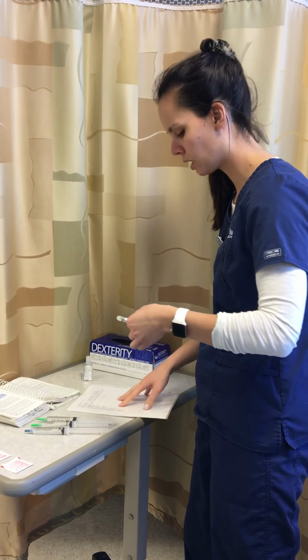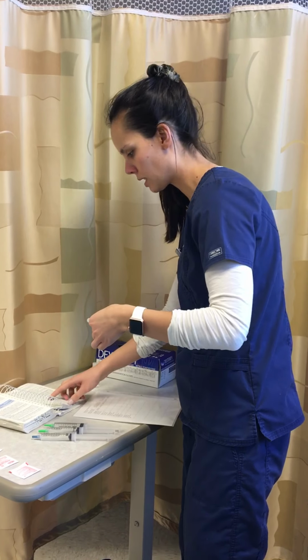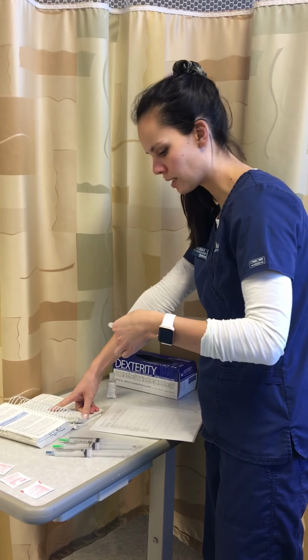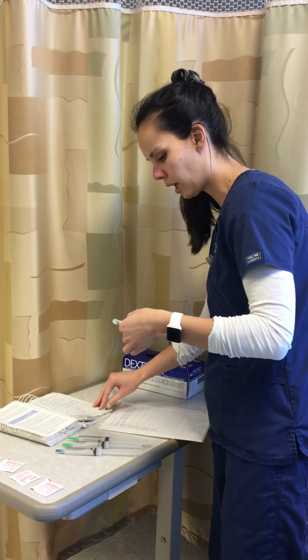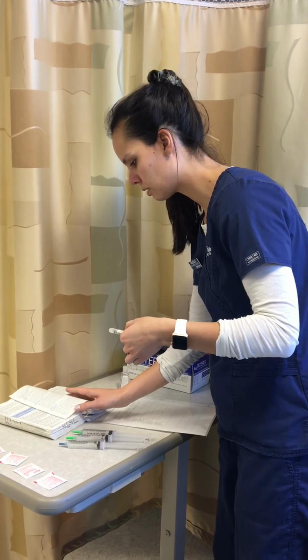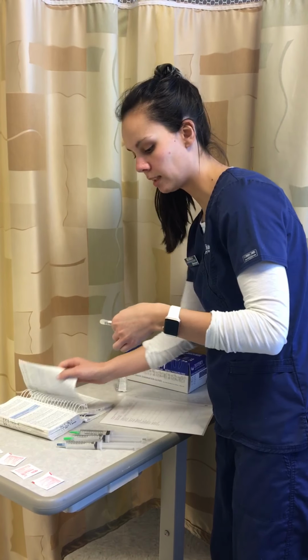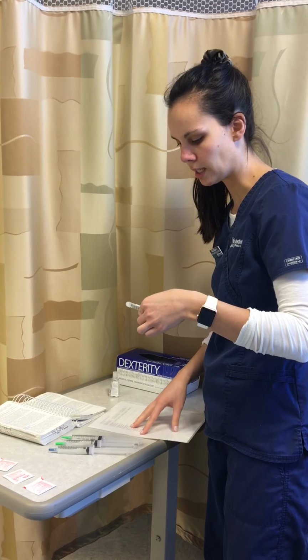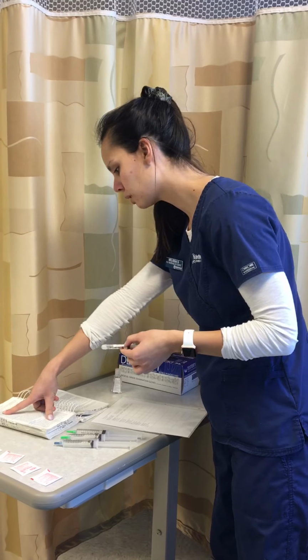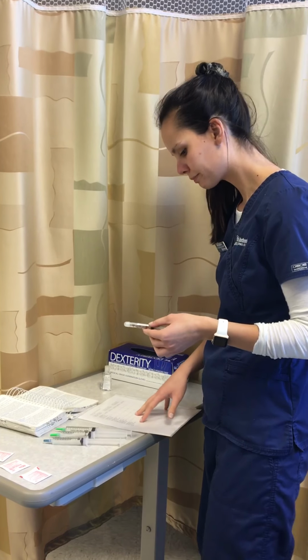I checked my Buddy book, and the Zofran is compatible with normal saline, it does not need to be diluted, and the rate for the Zofran is 2 to 5 minutes.